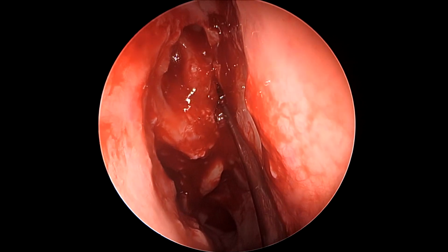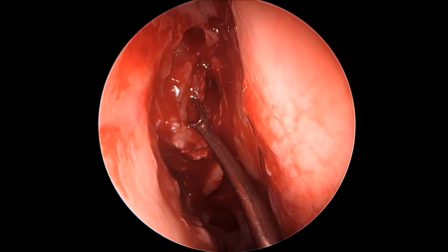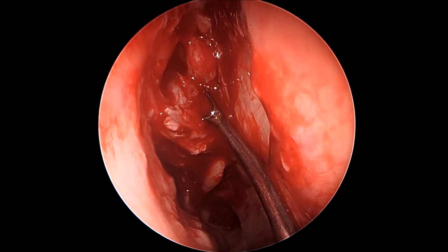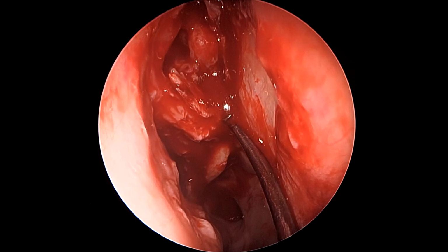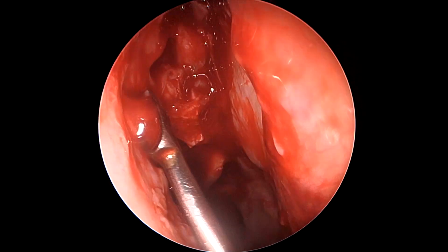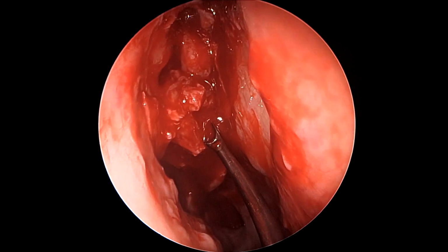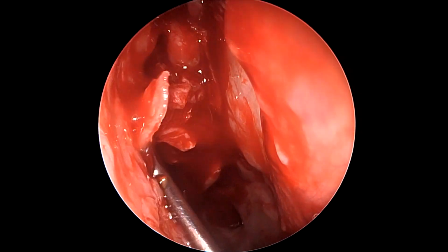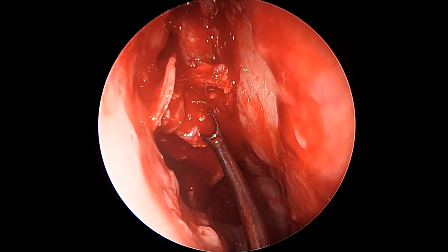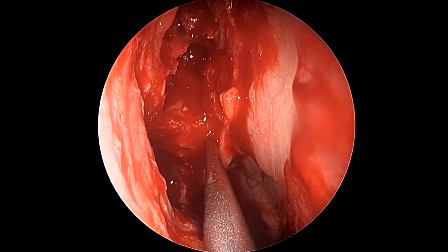These are important landmarks defining our trajectory into the sphenoid and the ethmoids. Now we begin removing the bulla ethmoidalis, again using a back fracture or swing door technique, where we use our frontal sinus seeker or a ball probe to fracture the ethmoid bulla anteriorly. This is again a safe procedure because the force is applied backwards. Thus, even if the force is more than usual or there is a jerk, there is very little possibility of injuring the skull base, unlike exerting force upwards.